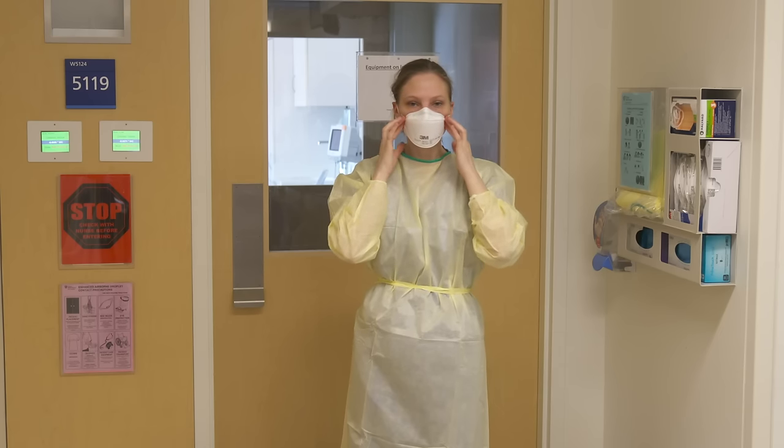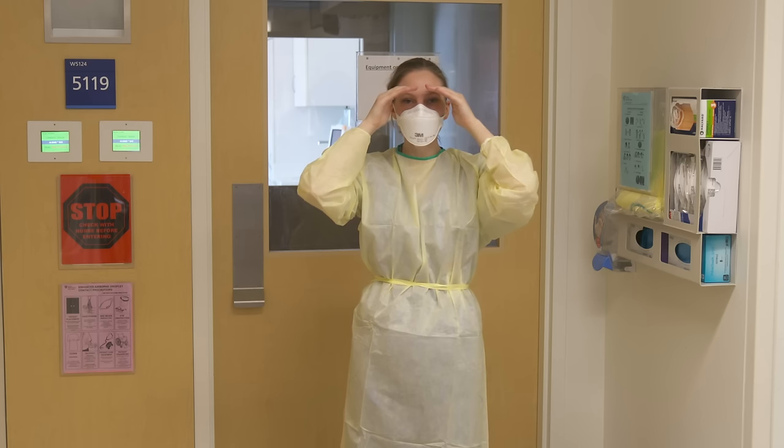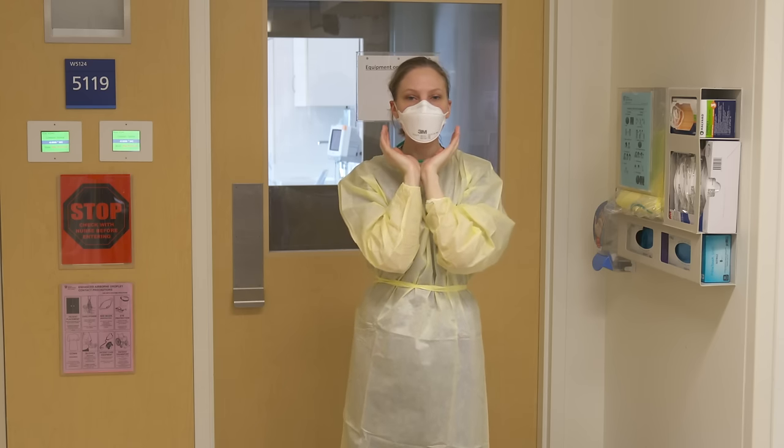Without touching the mask, perform a seal check by placing your hands at the top and bottom, while taking deep breaths to feel if any air escapes. If air is felt, readjust the mask for proper seal.